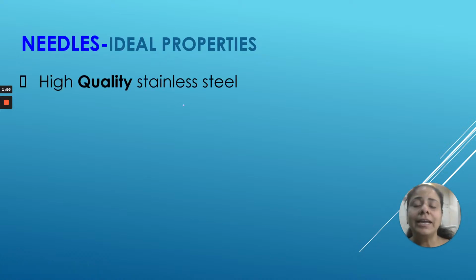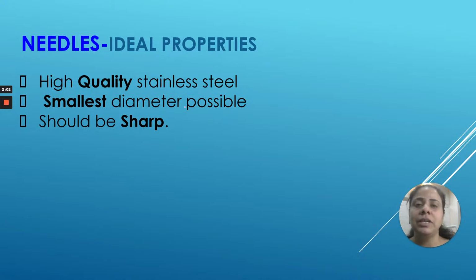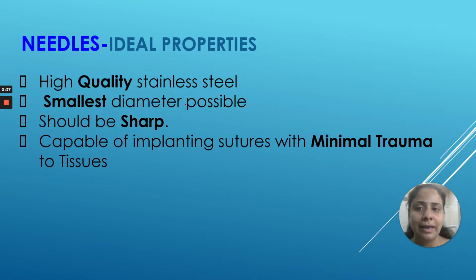It should be a high quality needle. It should not be a very big needle. It should be very sharp. It should not be dull at all. Because if we are buying very cheap sutures, or some people use reusable needles, they sterilize them again and again, they become dull over a period of time. Please do not do that. Buy pre-sterile sutures and use them. This is very good for practice. You can charge the patient 200-300 bucks extra, but do not re-sterilize or use the needles again and again.